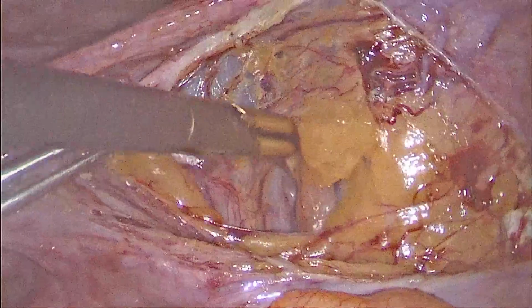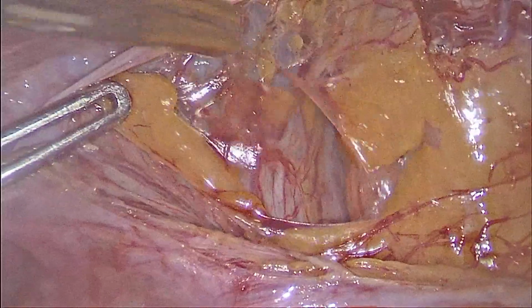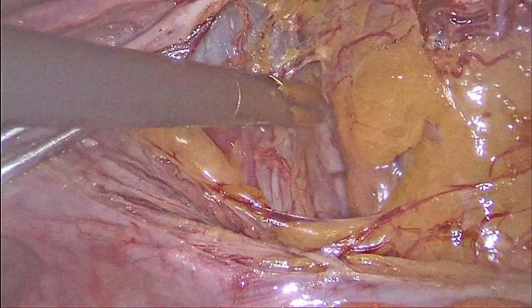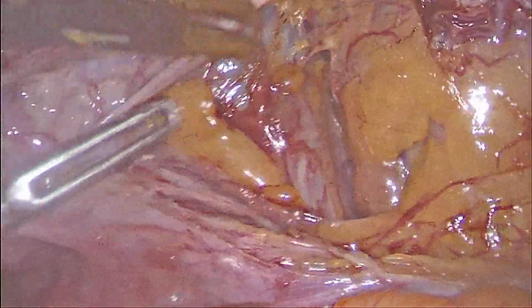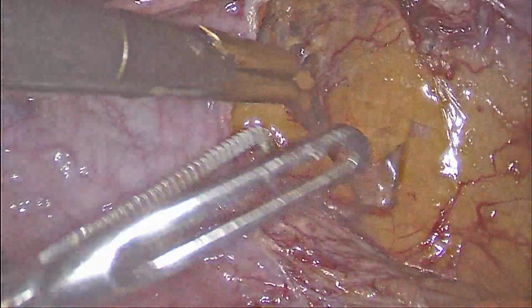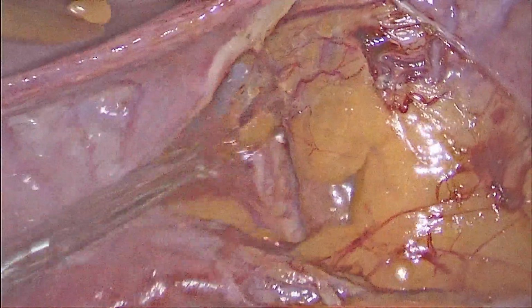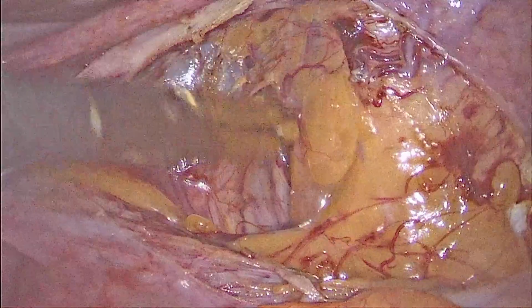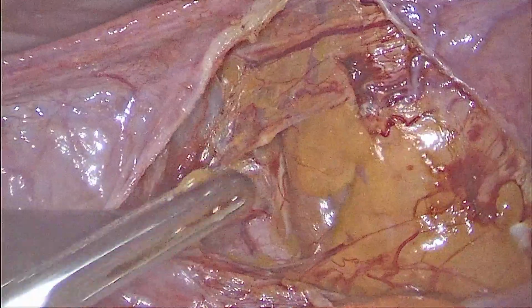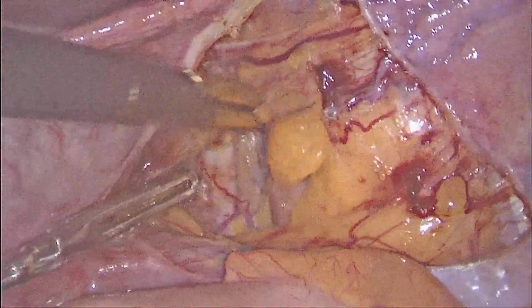Care should be taken that these small vessels running in the free fold of the peritoneum are not injured, which may stain the area and obliterate the anatomy. So there is the ureter, which is very well identified by its peristalsis.